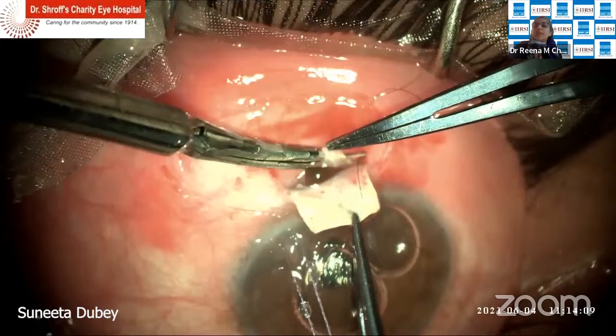Because it just maintains the chamber well and you're always in control. Yes, yes. Hold it quickly. So does anyone use viscoelastic? Very rare. I do not use methyl cellulose, but I might use sodium hyaluronate if I'm worried about chances of an intraoperatively shallow AC. Then I might put very little sodium hyaluronate in very rare high-risk cases, not routinely at all.